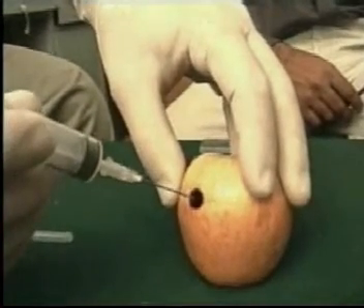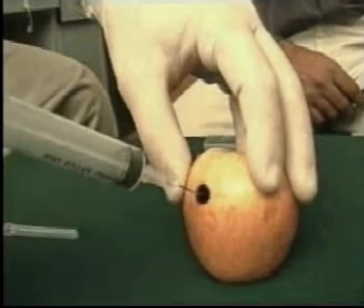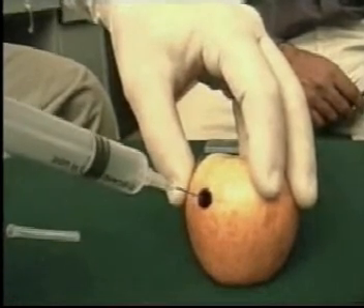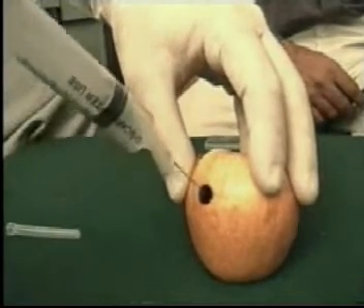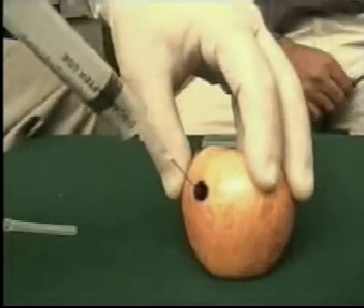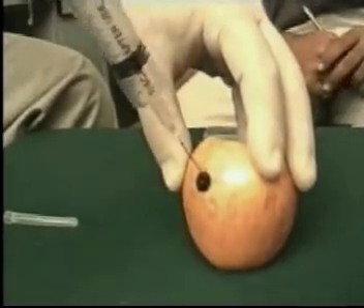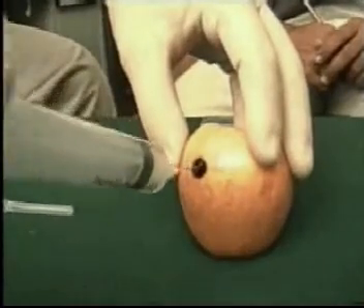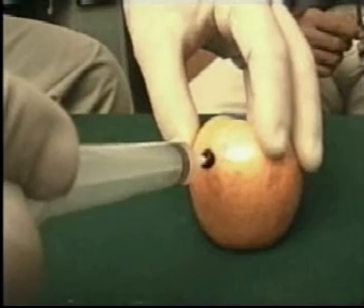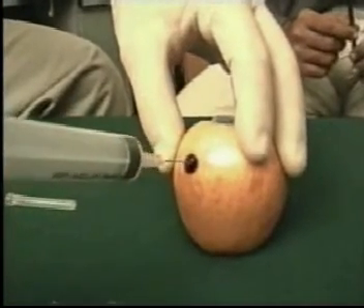With the right hand, go through the skin, entering the growth. Once inside the growth, a negative pressure is applied. It is a good idea to make a few passes in different directions while you are inside the region.